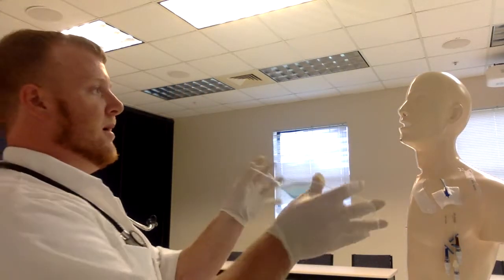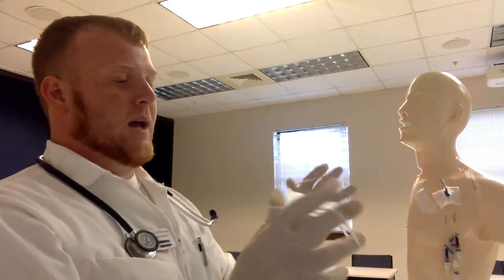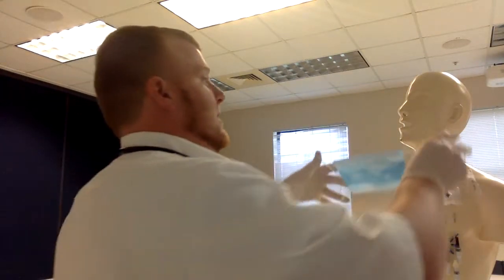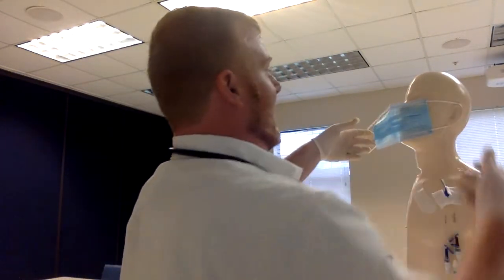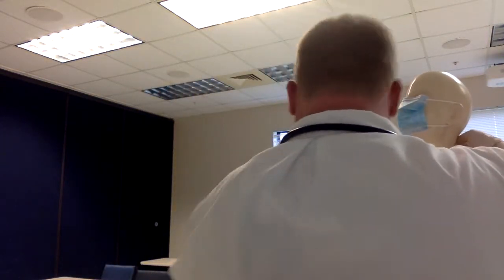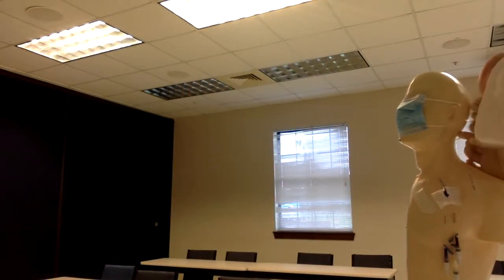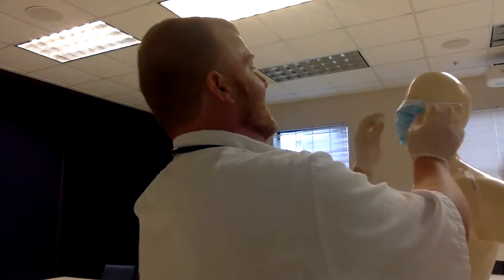We're going to go to the patient, and if feasible, make sure that the patient can tolerate it. Obviously, if the patient's having trouble breathing, then we're not going to put a mask on to restrict the breathing. For the video purposes, we're going to have this here. We put it on, and obviously get it out of their eyes and whatnot, so it's on as best we can.